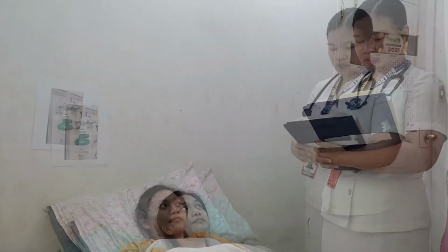Okay, good. So for our assessment, we will first determine the history, including acute and chronic health problems. Since you do not have acute and chronic health problems, we will now start to check your respiratory pattern, rate, depth, and rhythm. This will help us to determine your need of oxygen as well as your response to the therapy.